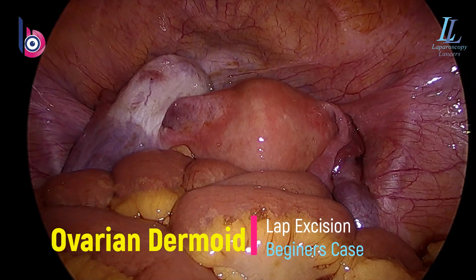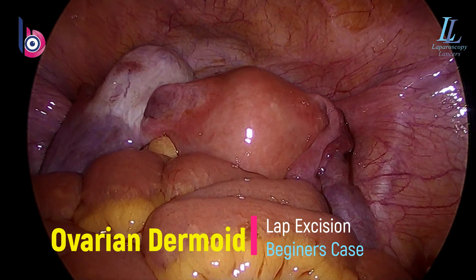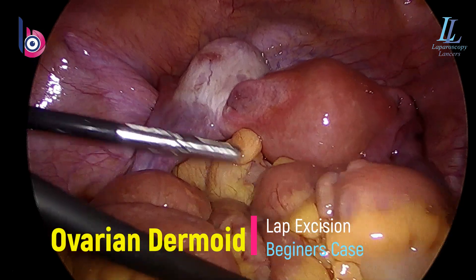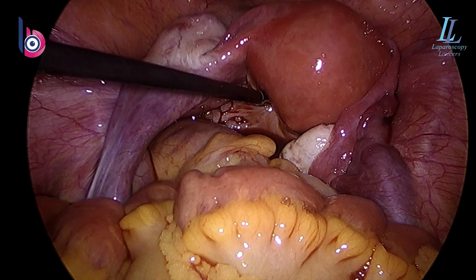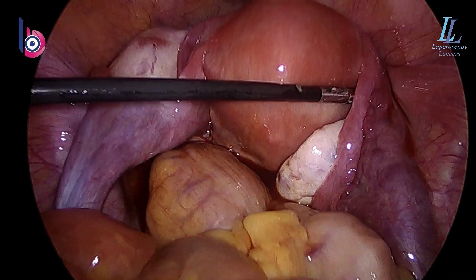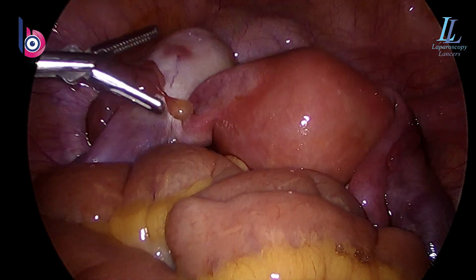Good morning friends. Laparoscopic ovarian dermoid surgery — a small one, four centimeters. Everybody can do it, please go ahead and do such surgeries by yourself. It can be one of your starting surgeries also. Standard 10 millimeter umbilical camera port and left two flank ports, 5 millimeter each. Later we'll be expanding one of them to take out the specimen.